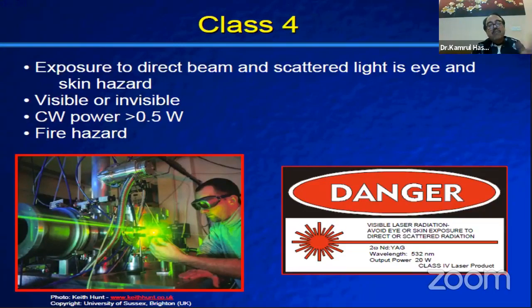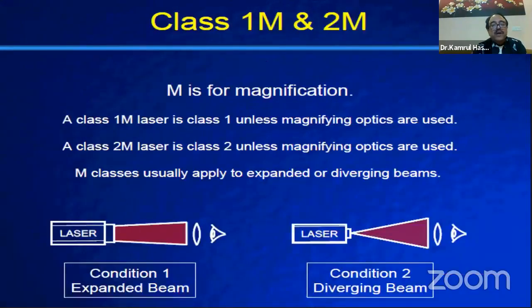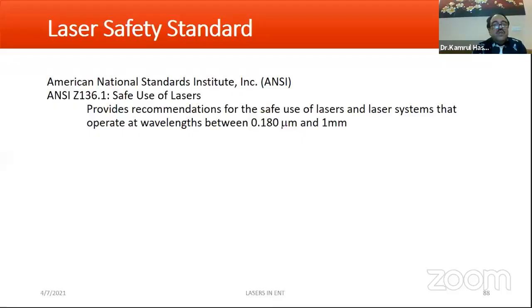So the operation theater should be equipped with the danger sign when the operation is going on. There should be a dedicated operation theater and dedicated anesthetists for this. What is laser safety? Why is the safety standard important? Very important, because it can be done under both local and general anesthesia. It is better to avoid local anesthesia.